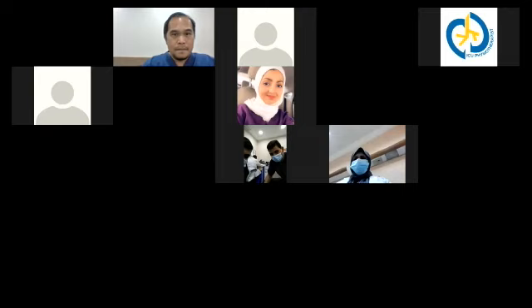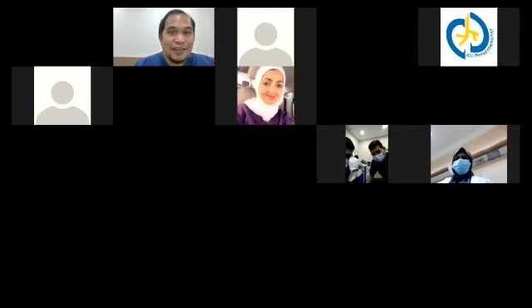Patients with ECMO, if they need chest physiotherapy, we can. It is applicable, but we have to be very gentle and avoid repetitive cough, because sometimes cough can change the pressures in the ECMO lines, and we suggest avoiding some compression on the ECMO cannula side. That's it, but it's applicable, and if needed, we can use it. Good, thank you. I don't see any other questions. I think it's clear.